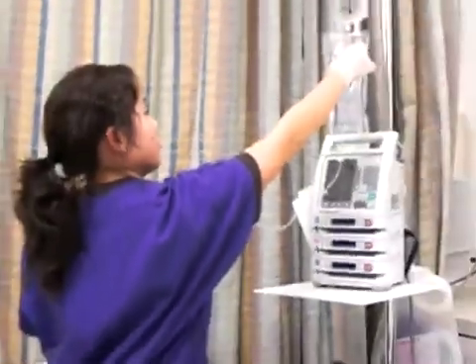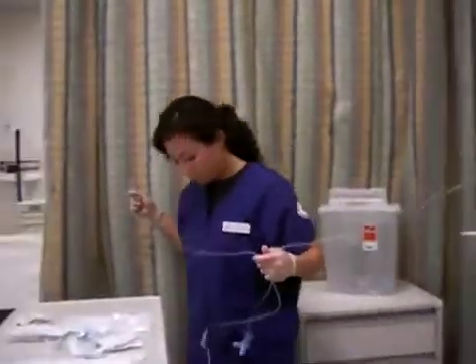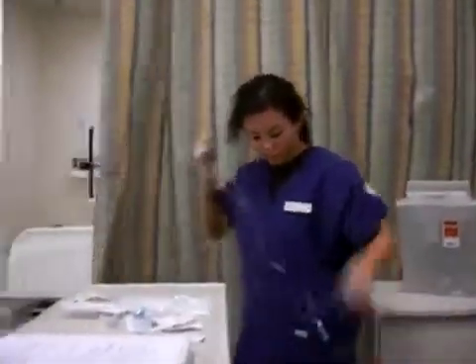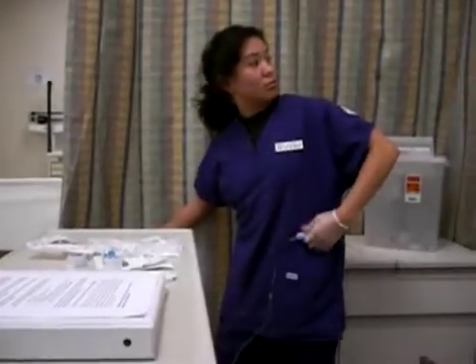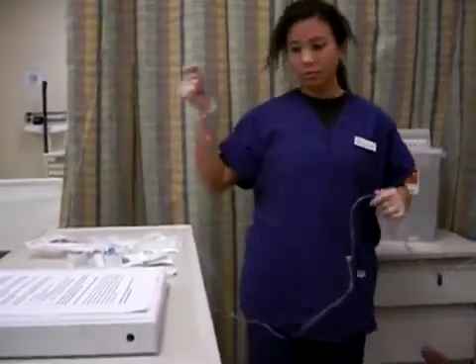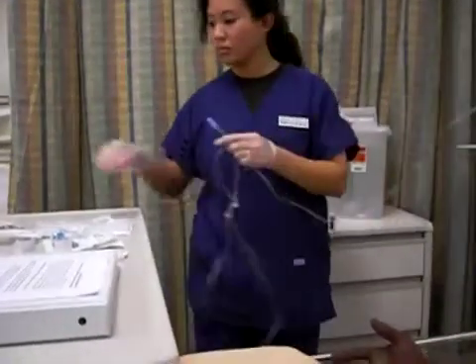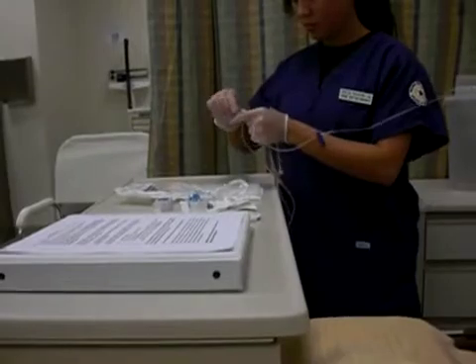The nurse compresses the drip chamber and fills it to 1/3 to 1/2 full. She then primes the tubing by filling the IV solution to the needle adapter. The tube should be free of all air bubbles. Once the tubing is primed, the roller clamp is closed off. The cap protector is placed on the end of the infusion tubing.